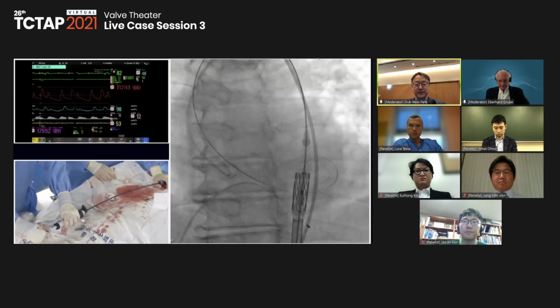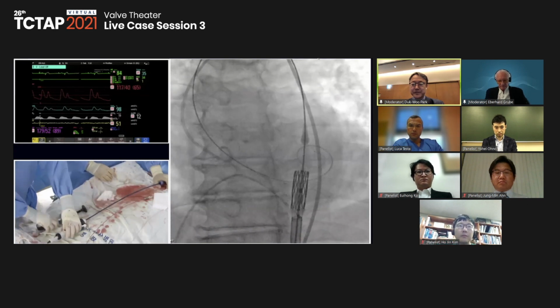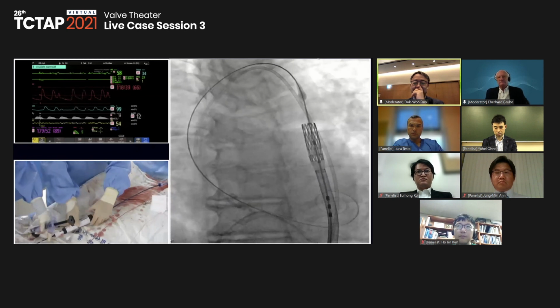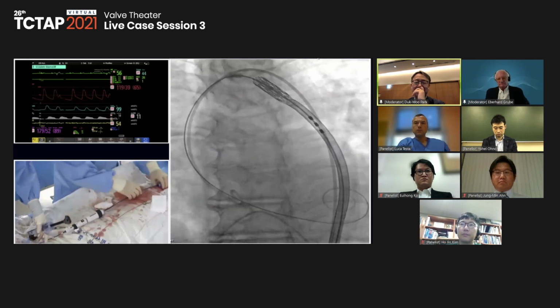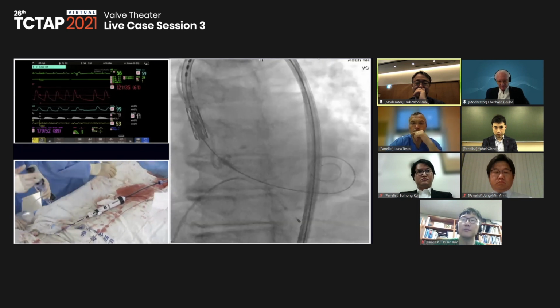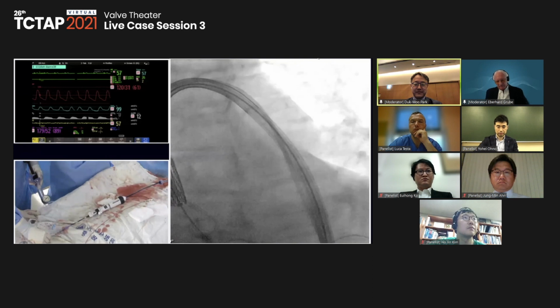Do that twice. And here is the target portion, but we unlock here and lock again and adjust the alignment again. Okay, got it. Okay, and then we pass the aortic arch over here, and then make a bend, and push smoothly, and make a bend, and push smoothly. Over here, we make sure of the initial default coplanar view, before insertion of the valve.